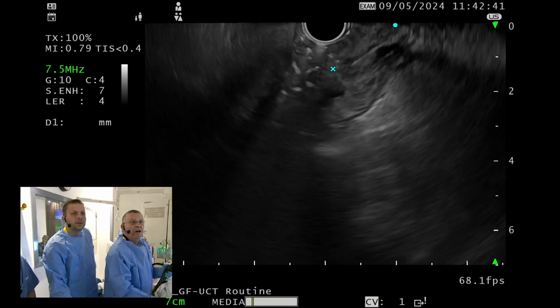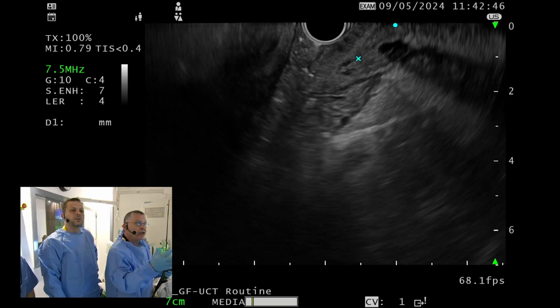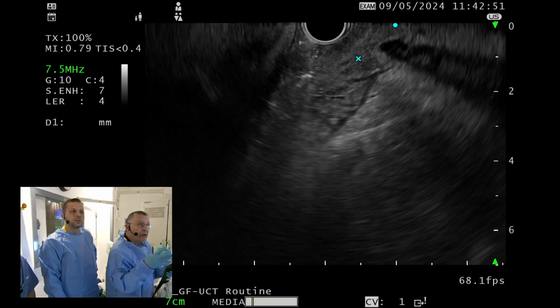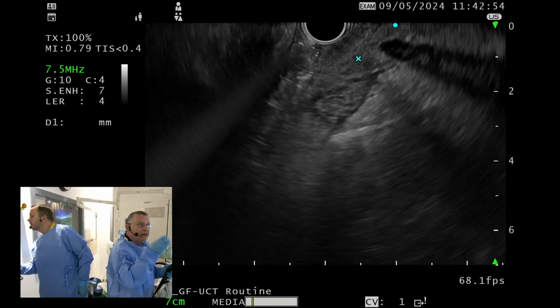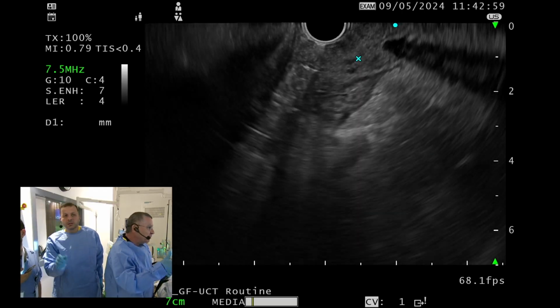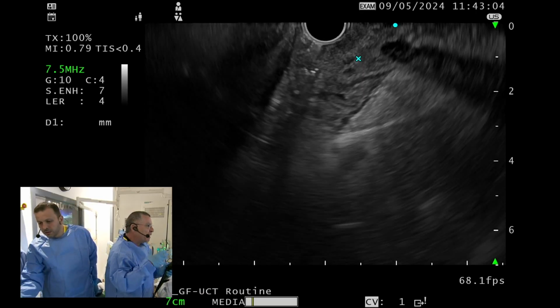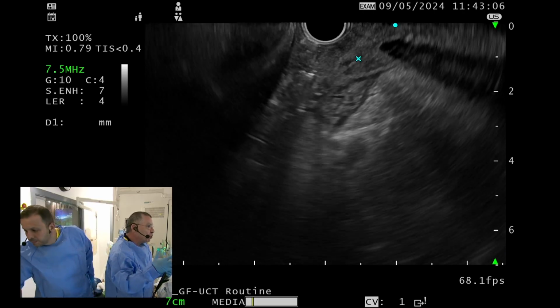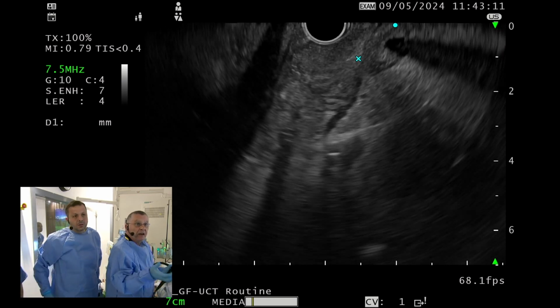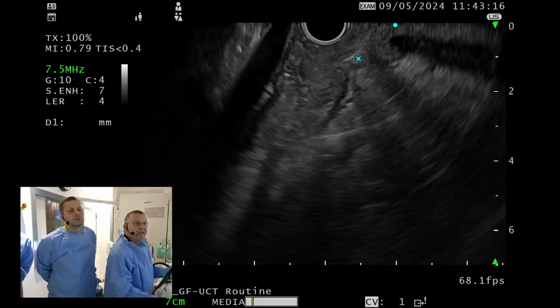Okay, right. So the problem is that you have a benign lesion on biopsy. When you look at it endoscopically, you do not find real signs of malignancy endoscopically, but the patient has jaundice, real jaundice, so you know that 94% will be adenocarcinoma, and you want to be sure that it's an adenocarcinoma. What do you do? You do an EUS, and you find this involvement of the muscle. It's finished, you know it's malignant.